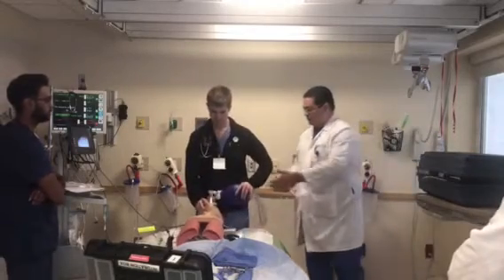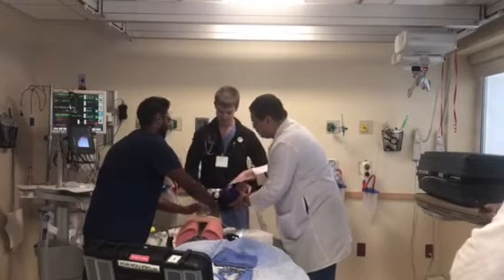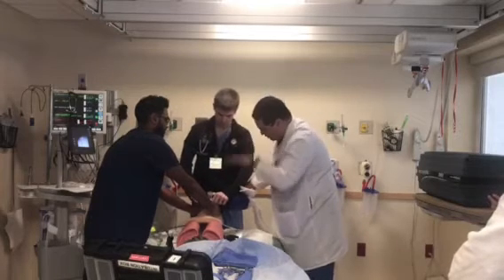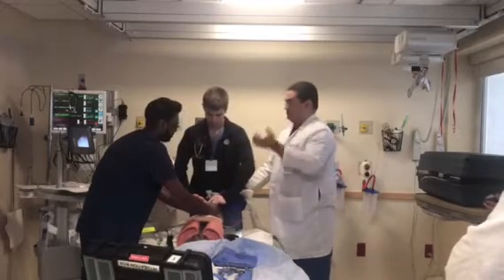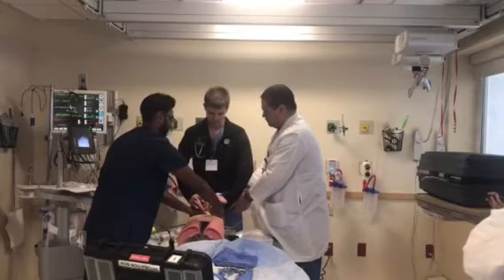As we talked before, he couldn't be ventilated, so we do two hands, and then teamwork. What both of you are doing is pushing the mask on the patient. Somebody has to put both fingers under the mandible and pull it up, right? So, yeah, even if the mouth closes, it's fine. Right, I'm ventilating the patient.